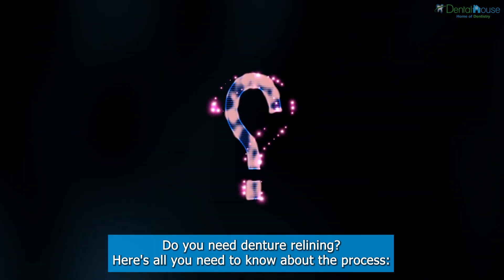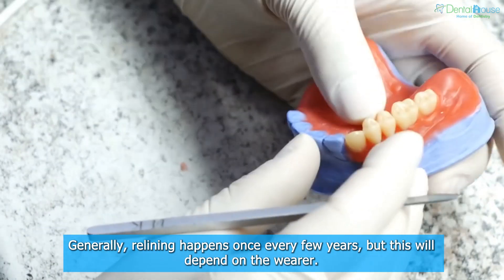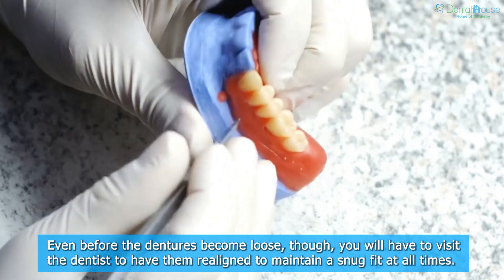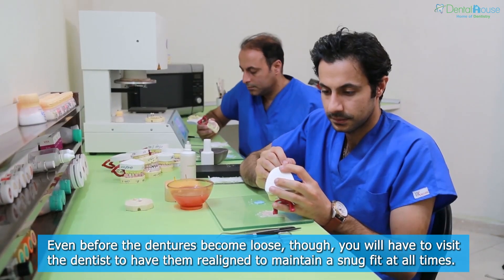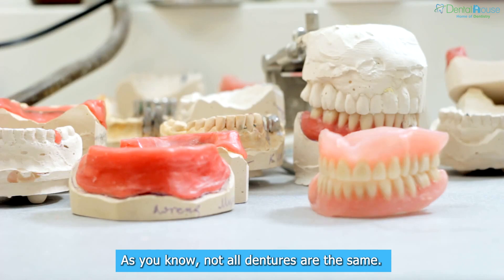Here's all you need to know about the process. Denture relining frequency: generally, relining happens once every few years, but this will depend on the wearer. Even before the dentures become loose, you will have to visit the dentist to have them realigned to maintain a snug fit at all times.